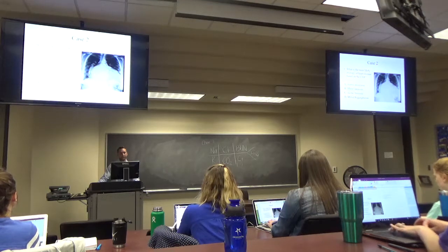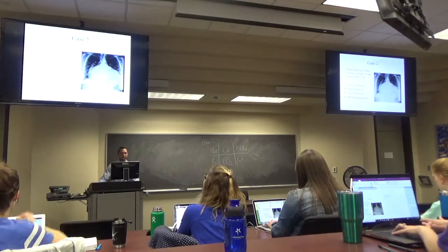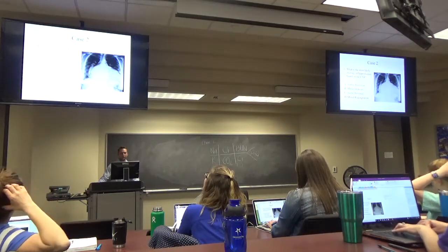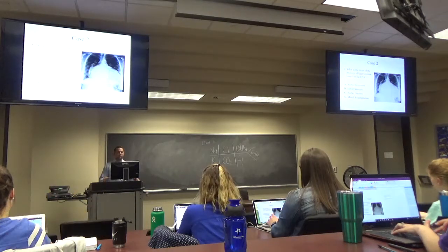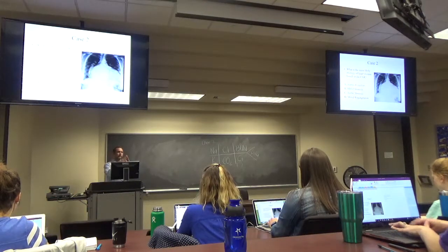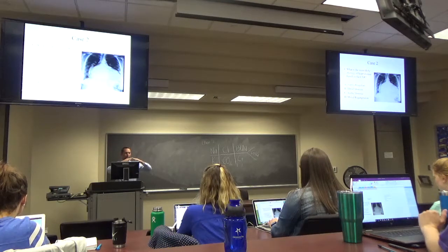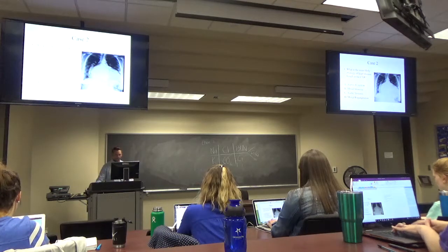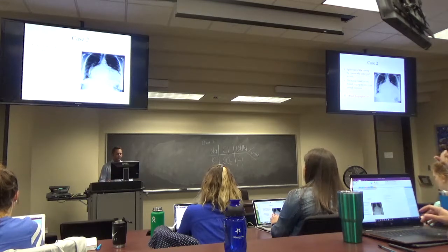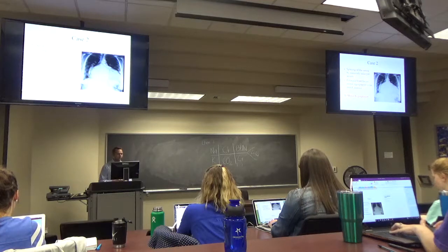And aortic stenosis, you might get an enlarged left ventricle, which is typical of aortic stenosis, but not a massively dilated heart. Another thing that this X-ray shows is if you can see the carina clearly right here. This is called splaying of the carina, which means the carina is normally at an acute angle, and if it's pushed into more of an obtuse angle, more than 90 degrees, it's called splaying of the carina. Those are the two findings. And the enlarged heart also favors regurgitation over stenosis, like we were saying earlier.